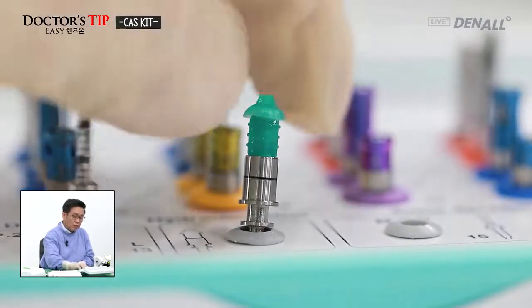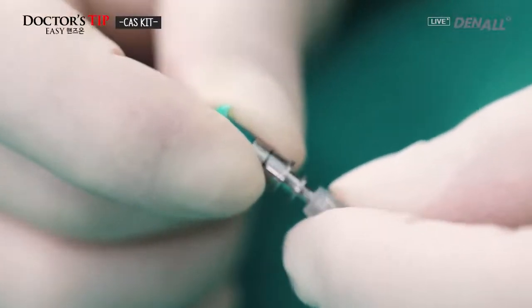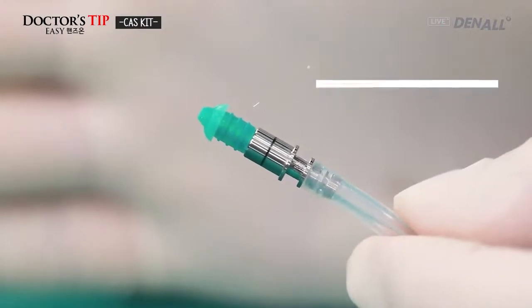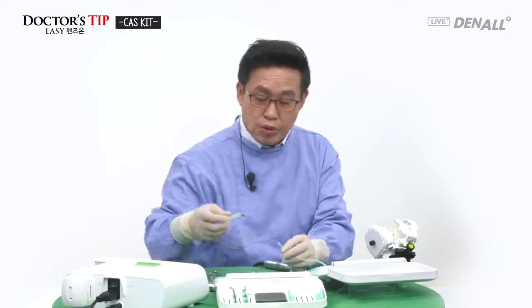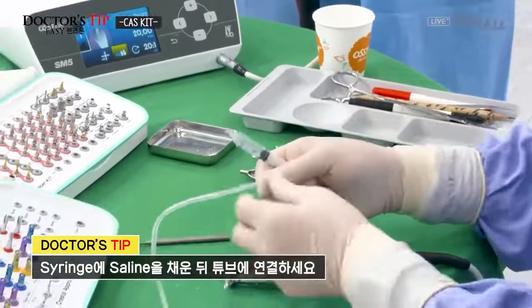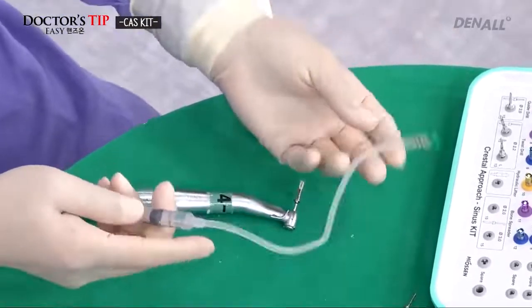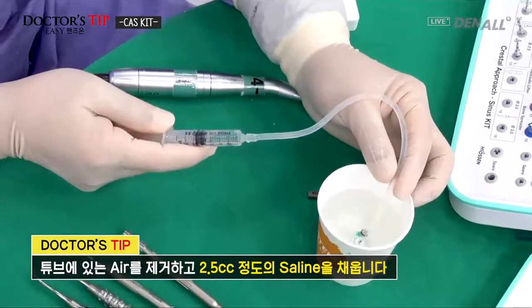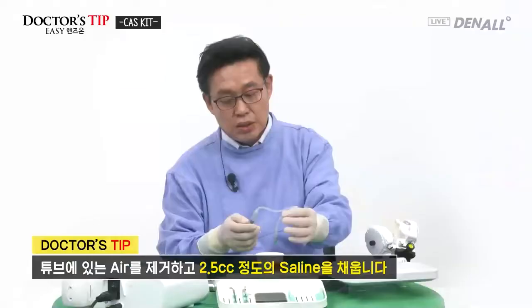The hydraulic lifter is removed and connected to the silicone tube. Next, saline will be infused. A lot of air in the tube is not very good. So a 3 cc syringe will contain enough saline and it is connected like this. Then, if you see here, there's air inside. Saline is infused to remove the air and it is sucked out. The 3 cc syringe is filled with up to 2.5 cc saline.